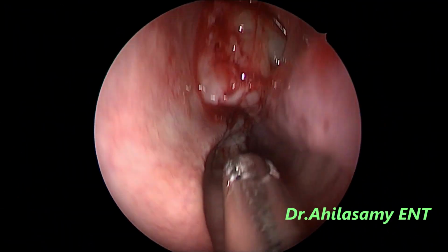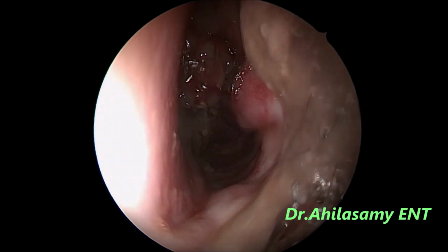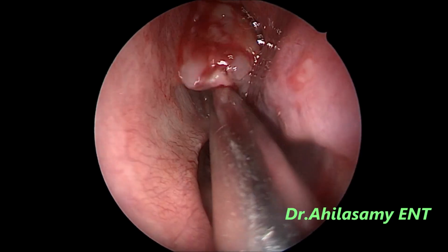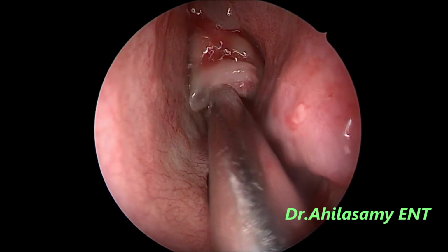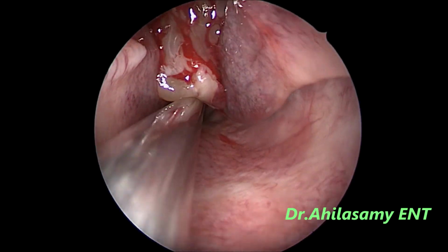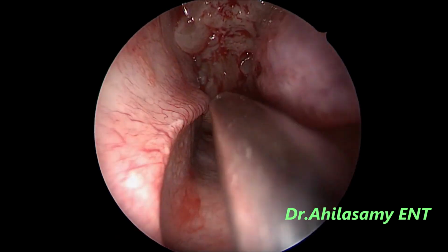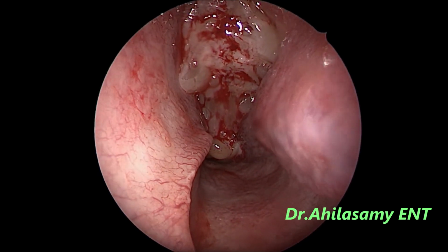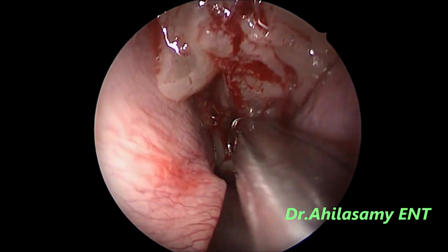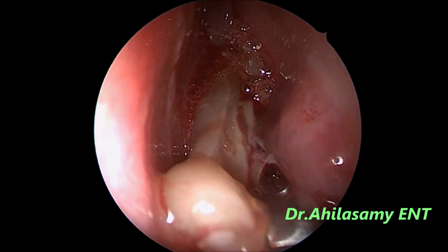And the service of it is very, very cheap. Maintenance is also very easy. Of course, you have to maintain the motor, that is the handpiece, by good washing, suction, and oiling the handpiece. The whole procedure is done with this Bansari Marketing shaver system with the Zoma debrider blade. Of course, the suction is very important. Here I am using the central suction because I operate only in corporate hospitals.